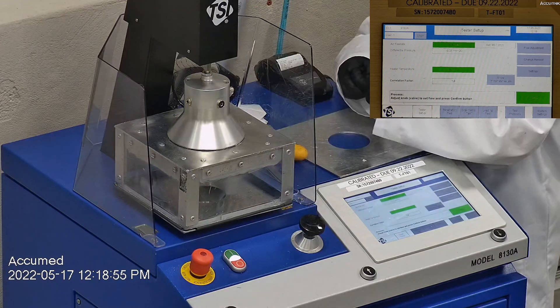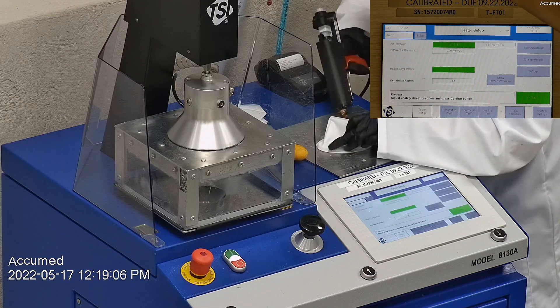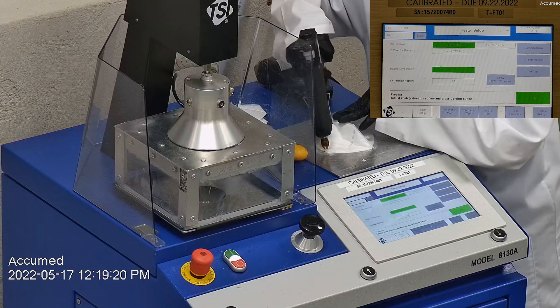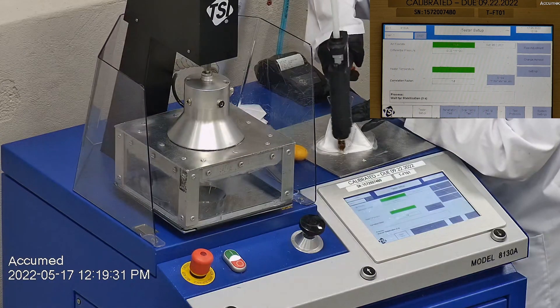When applying the hot melt glue we make sure that there are no holes or leakage around the seal to ensure accurate results. The testing plate is then attached to the frame and the box is placed under the TSI filter holder for testing. The results are displayed on the TSI monitor.